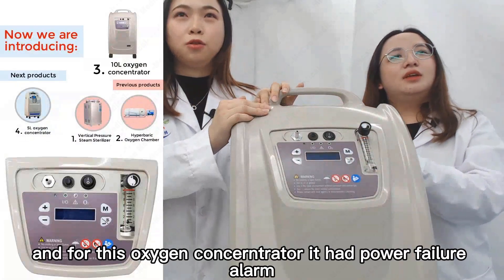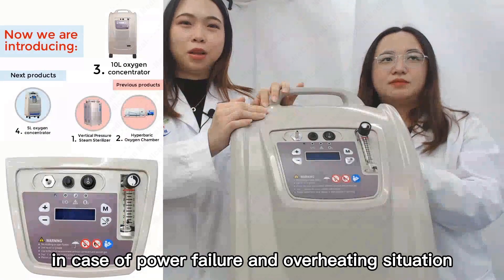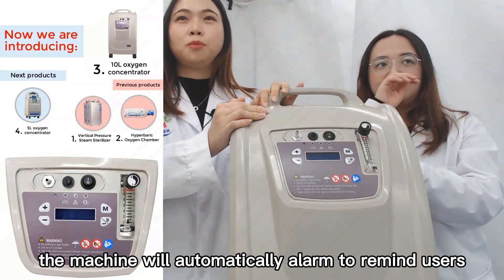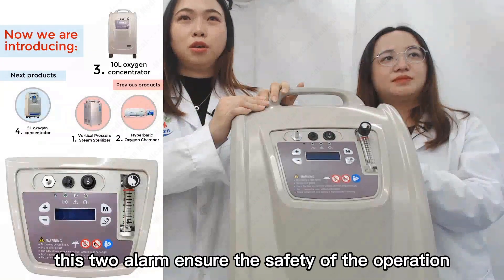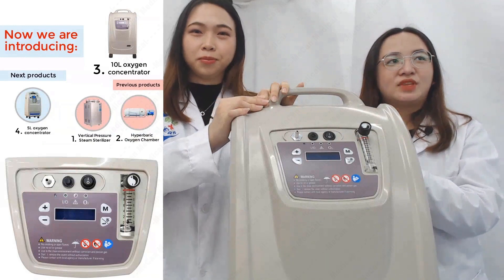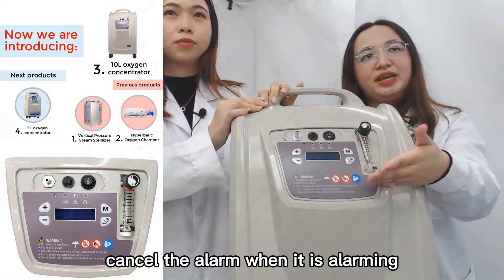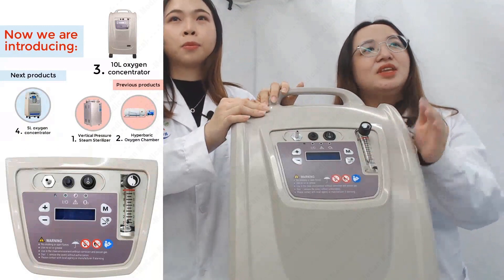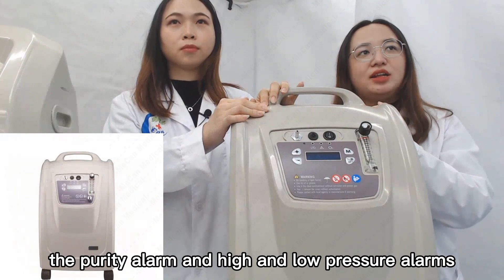For this oxygen concentrator, it has a power failure alarm and overheat alarm. In case of power failure or overheating, the machine will automatically alarm to remind users to check the machine in time. These two alarms ensure the safety of the operation process and the long-term life of the machine. You can press this button to cancel the alarm when it is alarming. We also have optional alarms such as purity alarms and high and low pressure alarms.